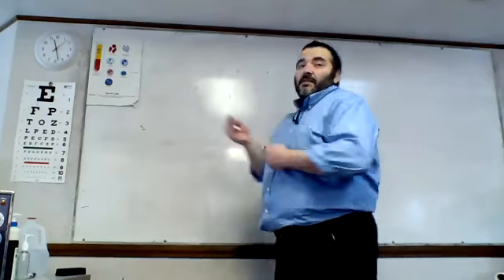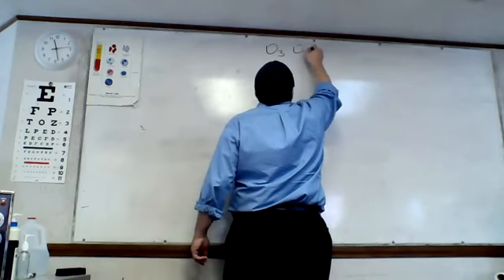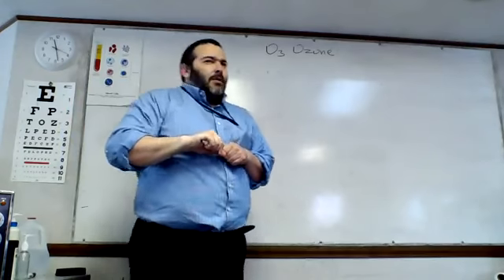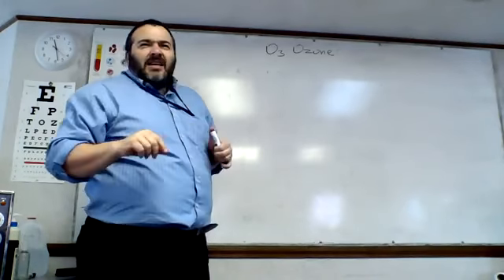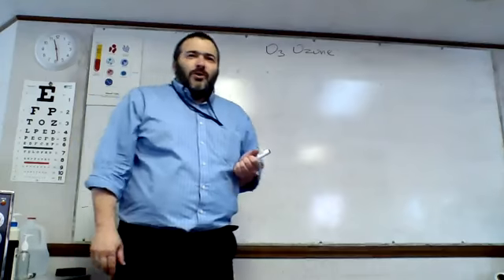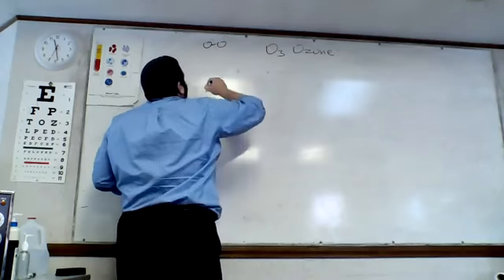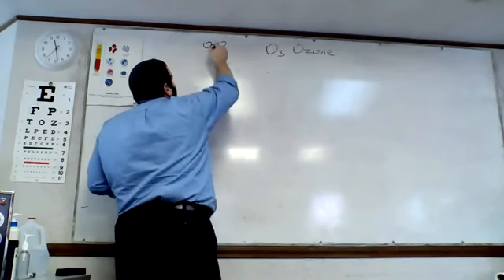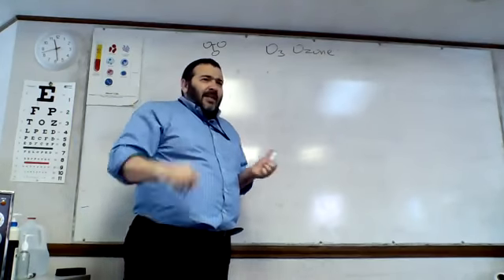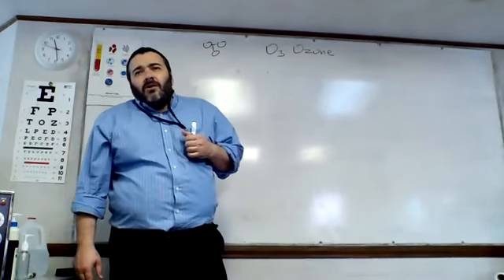All right. Last but not least, O3, also known as ozone. What the heck is O3? Well, I just said it's ozone, but it's very close to O2, is it not? If O2 is O and O, that would be oxygen. Put one more O, and you got O3. So it's still an oxygen, it's just a different type of oxygen molecule that we call ozone.